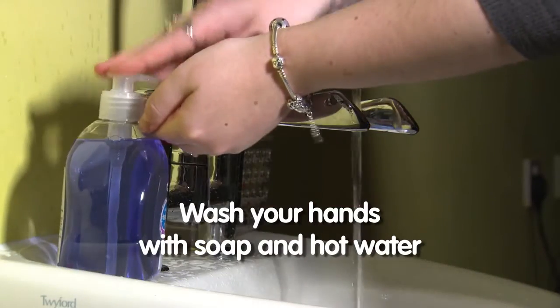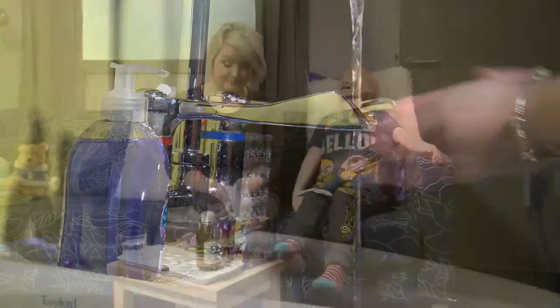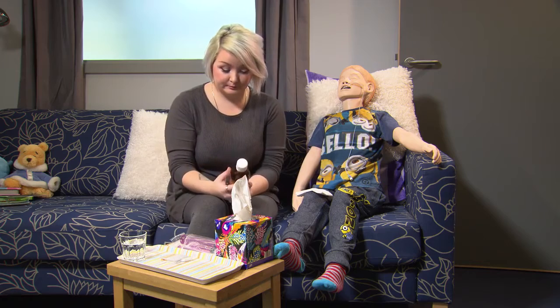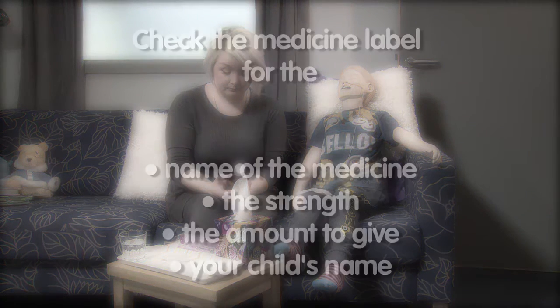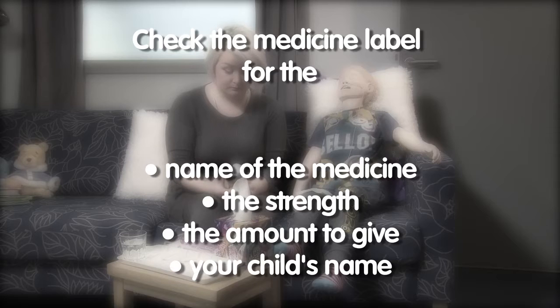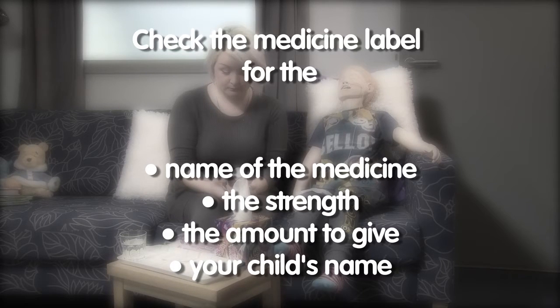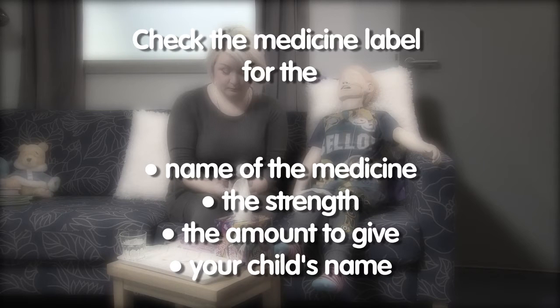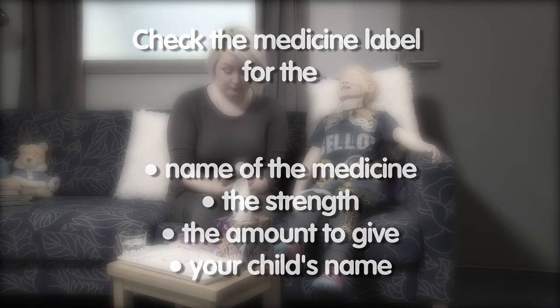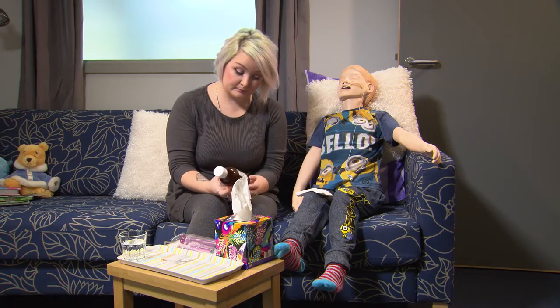Wash your hands with soap and hot water before starting. The first thing to do is check the label to make sure you know which medicine you are about to give, and also check when it expires. This is especially important if you have more than one medicine to give. The label will have the name of the medicine, the strength, the amount to give, and your child's name. For older children, you can explain what you are going to do to help reassure them.